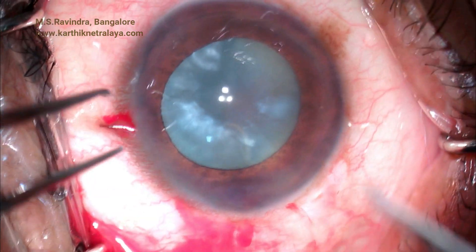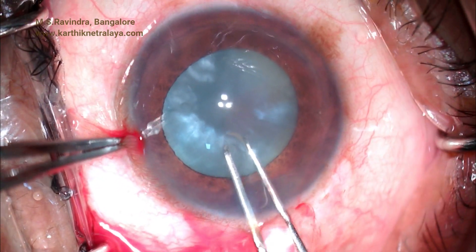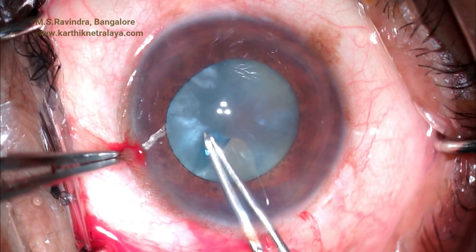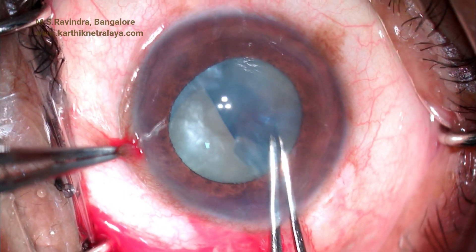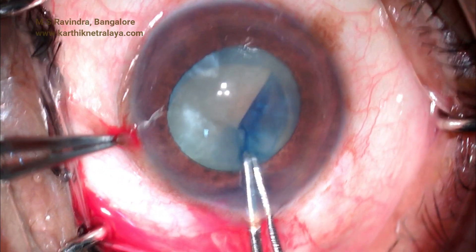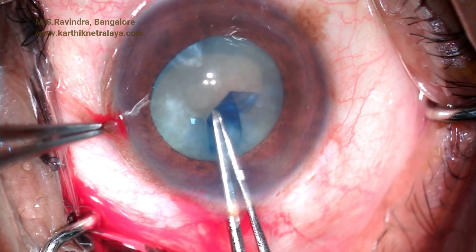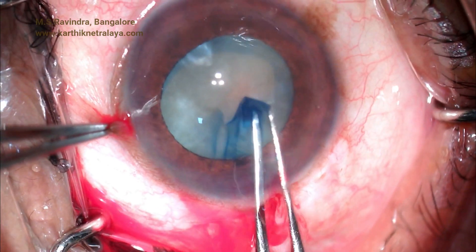Utrata forceps is used to initiate a rhexis from the puncture that was made. One arm of the puncture has gone to the periphery, so that is picked up, the capsule is pulled radially inwards, and the rhexis is completed. This way an intact rhexis is obtained, though it is large and eccentric.